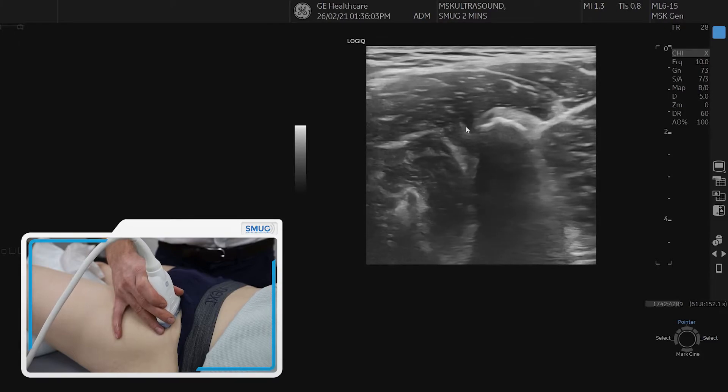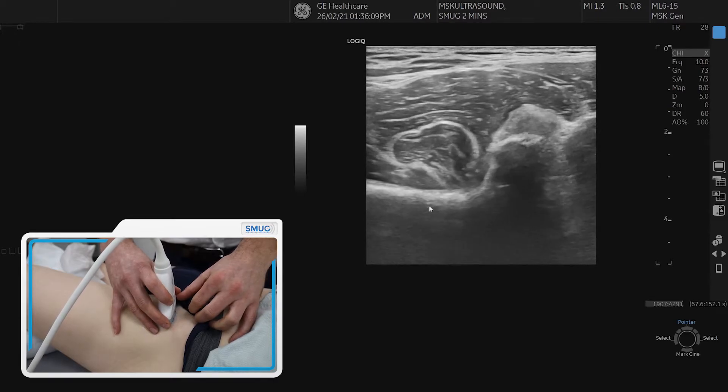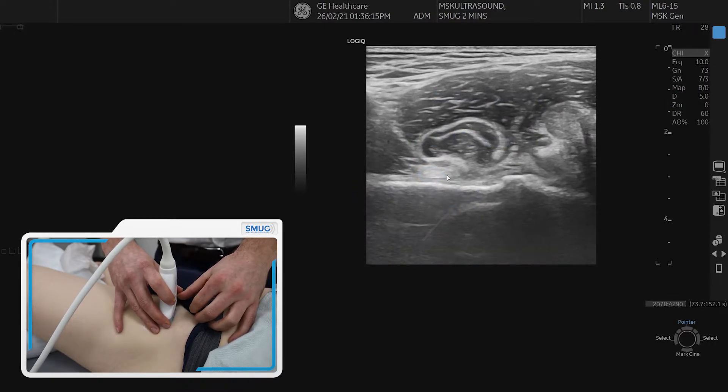If we move the probe medially and the most medial aspect of the probe slightly distally, then we can see a nice white hyperechoic round structure, which is the psoas tendon.